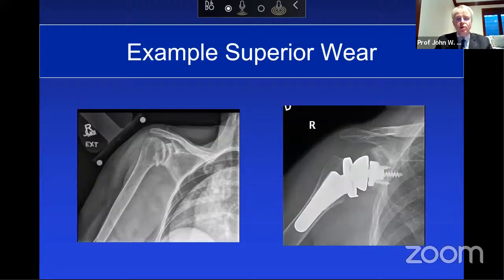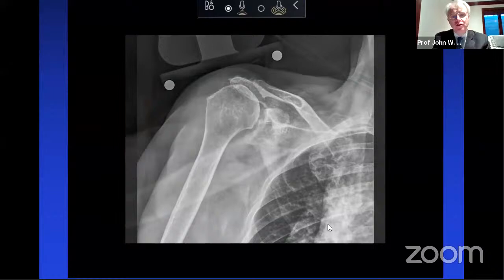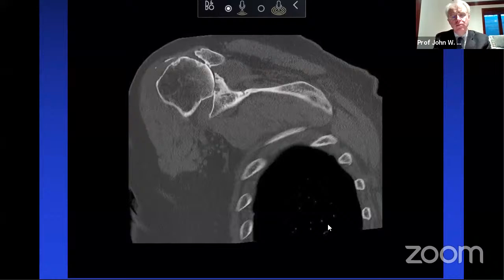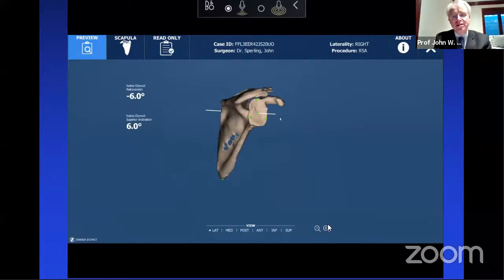And what I thought I would show now is a case of mine of a standard reverse arthroplasty of the shoulder. This is a patient with rotator cuff arthropathy we can see here. We get a CT scan on all the patients to be able to plan the case. You can see this patient has some superior glenoid erosion. And what we'll do is we'll go ahead and plan the case. So we can see, we'll put this in there. This patient has 6 degrees of superior tilt.